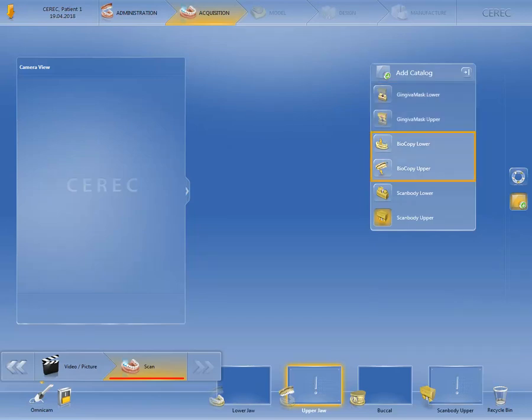The biocopy lower and upper image catalogs are automatically added if you have selected the biogeneric copy design mode in the administration phase. These image catalogs are used to acquire the morphology of the tooth to be replaced prior to extraction.